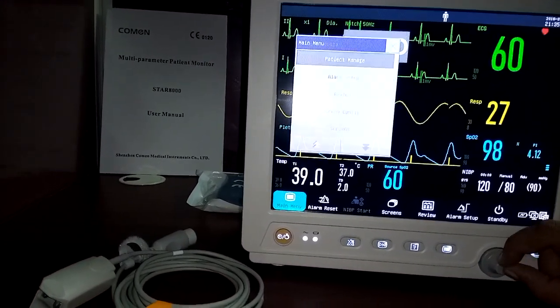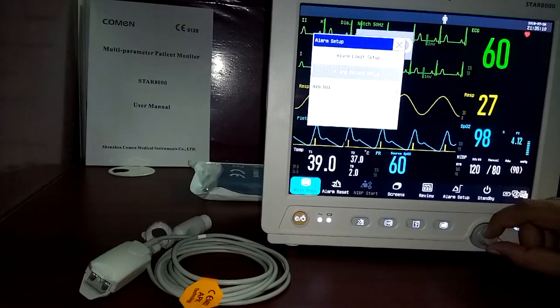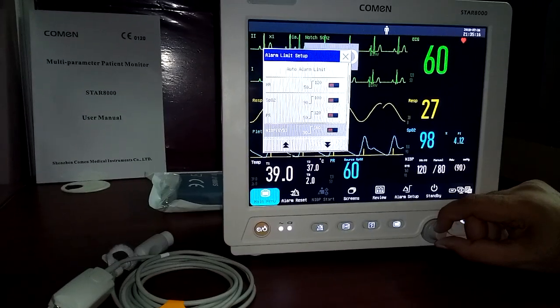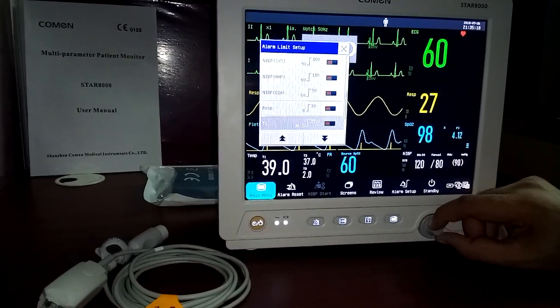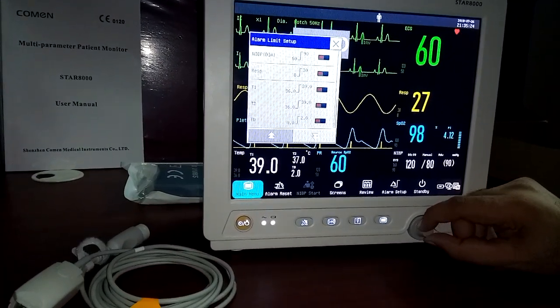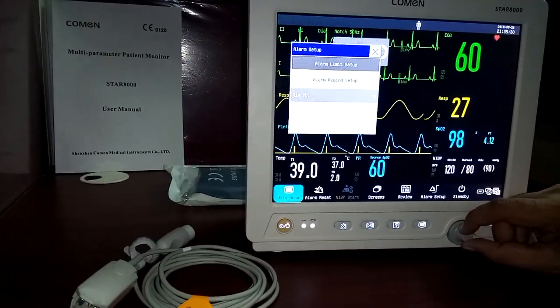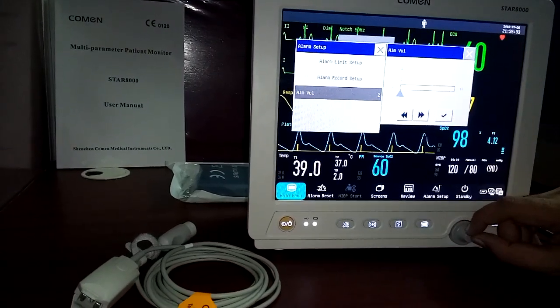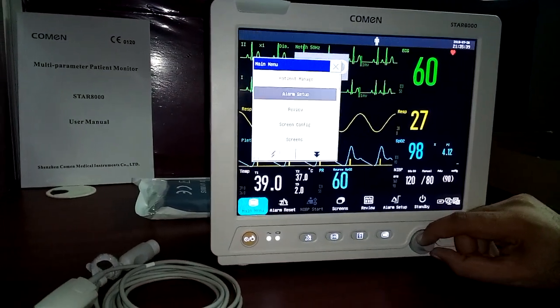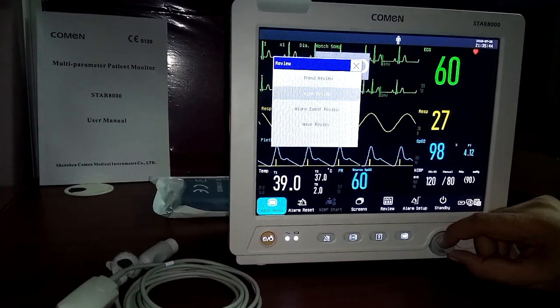In the alarm setup menu, you can set all alarm limits — heart rate, SpO2, pulse rate, NIBP mean, diastolic, systolic, respiration, temperature, and temperature difference. All alarm limits are configurable here. Alarm volume can be set from 1 to 10 on this scale.